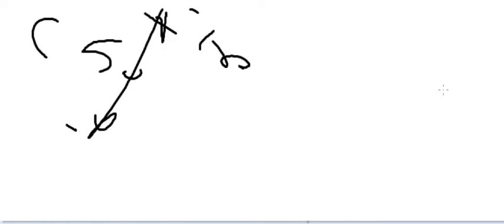Okay? Now, if I want to make a bone window, the main trick is in the center. The center has to be high, near the bone density. The bone density we said is around 1000, right? So the center I will put at something around 800, maybe 700, 750. There is no fixed number. It's not like 700 is correct and 750 is wrong. This is not correct, it is around. Okay? So we put the center at 700 or 800 and the window width is good. We'll put something like, let's say, 400 maybe. So it will be from 1000 to 600 with center 800.